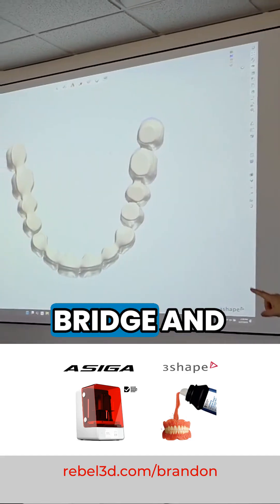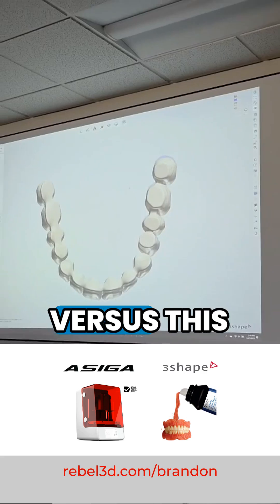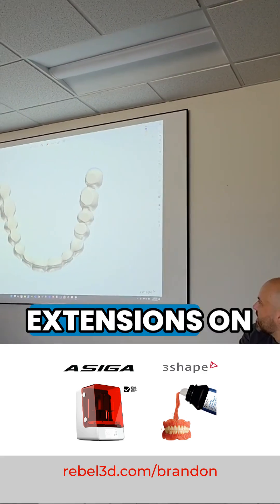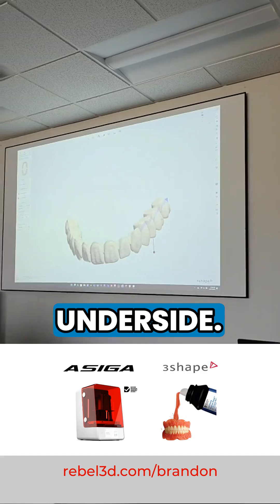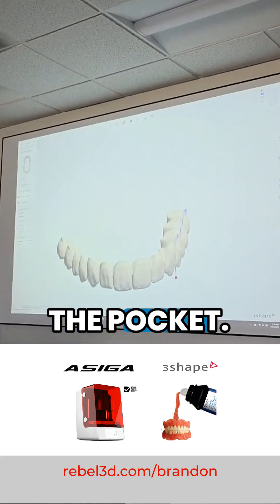The patient's right side bridge and the anterior bridge — see how nice and rounded all of it is, versus the left side bridge, which still has the long extensions on the underside. That's what it's changing. It's basically setting the path of insertion of those into the pocket.